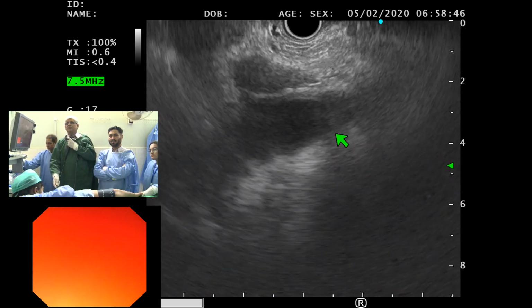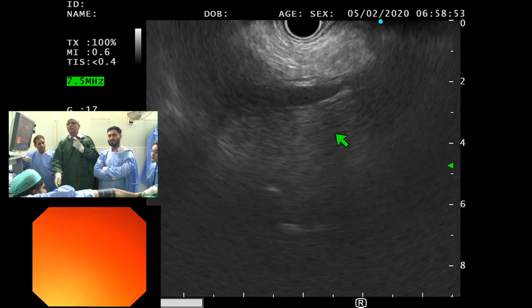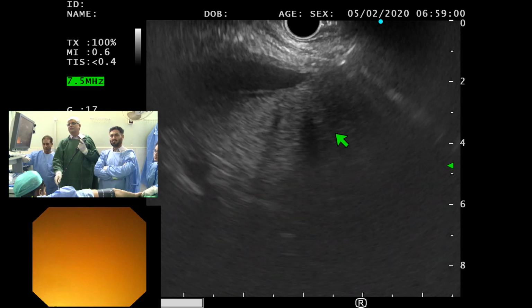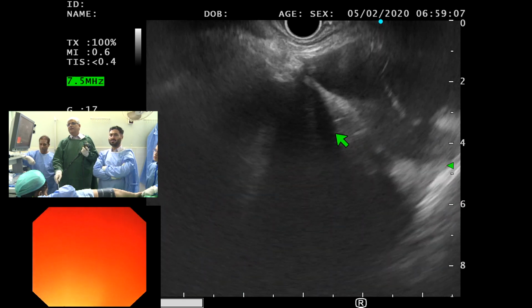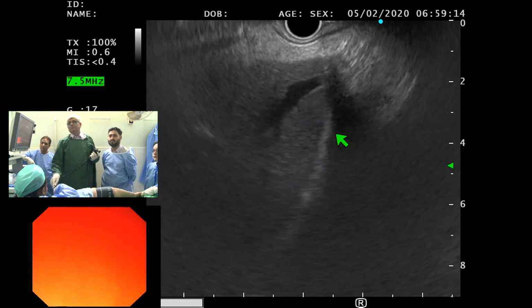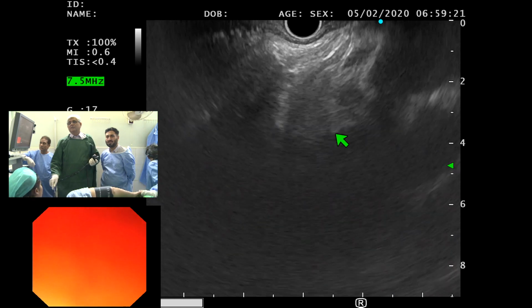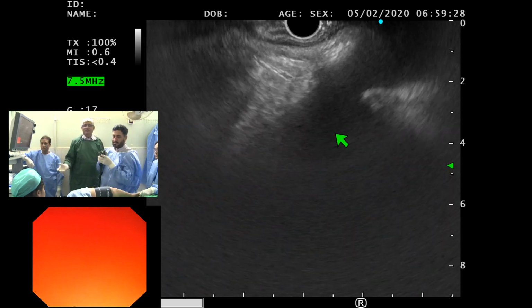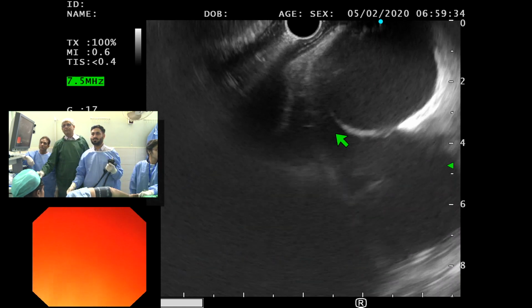And this IVC you can, if you keep pulling back, keep pulling back. I'm going a little anti-clock, pulling back, a little more anti-clock, pulling back, following IVC, letting go. So we follow it, and we've come to the heart there. That's the right atrium. Okay, so we can follow the IVC all the way to the right atrium. I think in the liver I couldn't see any. You saw the liver thing. Just have a look at the mediastinum, will come out. I think the area of interest here we have seen. So I would have my scope tip up a little bit.